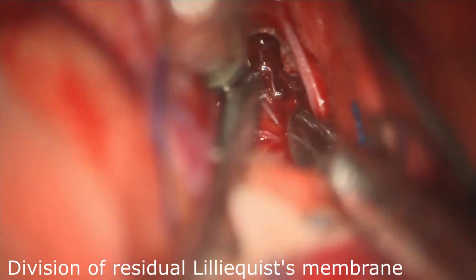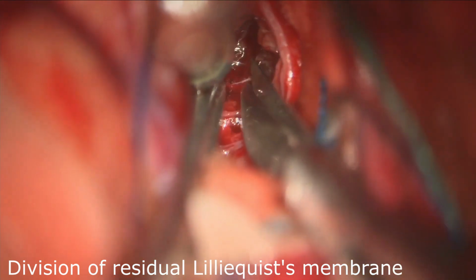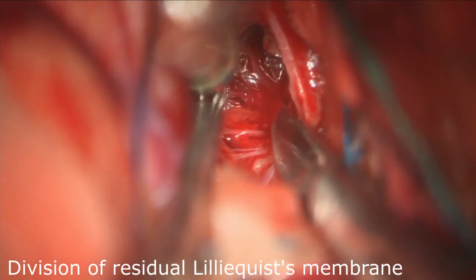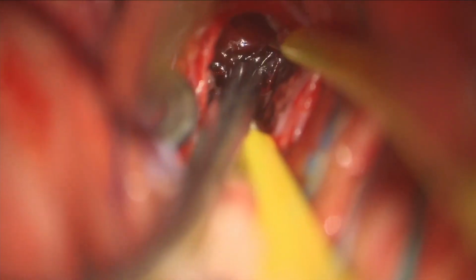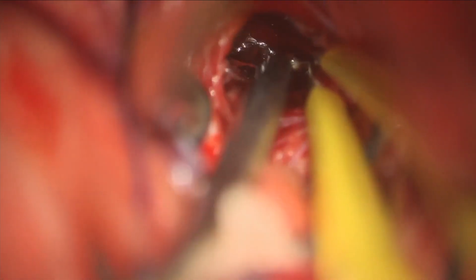And now we turned our attention to identifying the basilar trunk. We're working through subarachnoid blood, and the residual Liliequist membrane was divided. And eventually, after working through a significant amount of blood, we identified the basilar trunk, which you can see here.